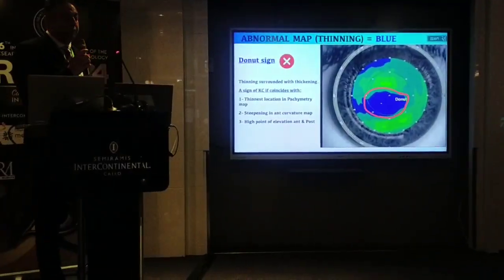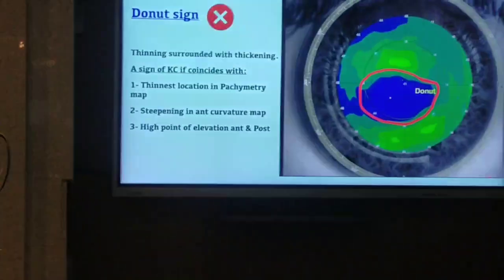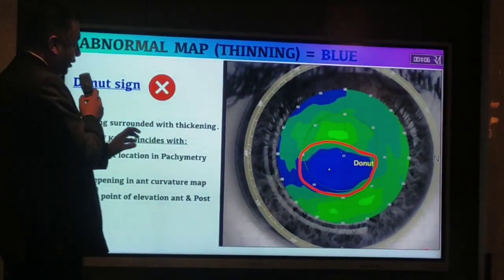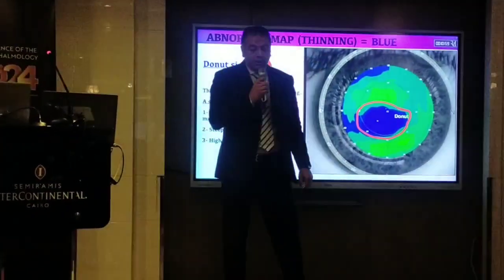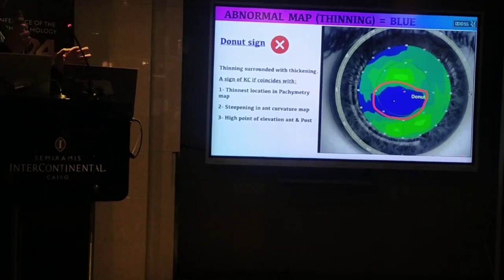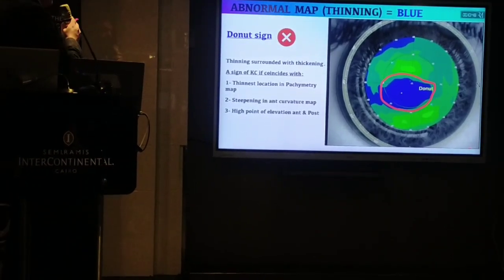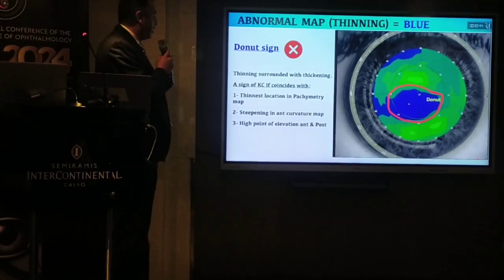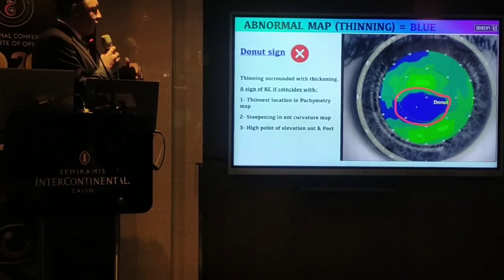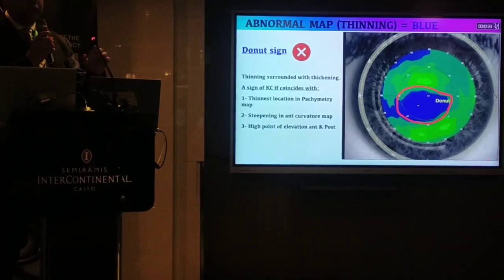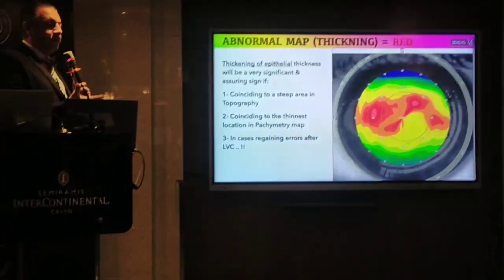Now look at the abnormal maps. The most important one is the donut sign formation, which is an alarming sign. The donut means thinning — an island surrounded by thickening around it, like an island and its borders. The characteristic sign should be thinning surrounded by a border of thickening. This thinning surrounded by thickening is a sign of keratoconus if it coincides with the thinnest location in the pachymetry map, the steepening in the anterior curvature map, and the high points of elevation — especially posterior elevation.